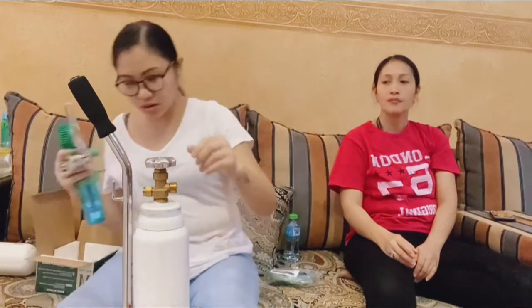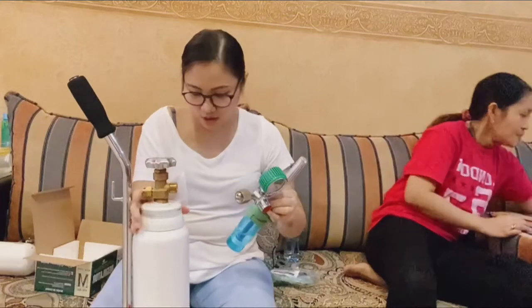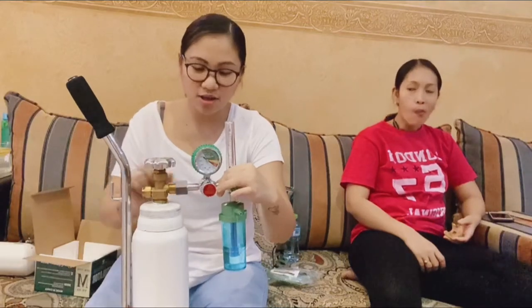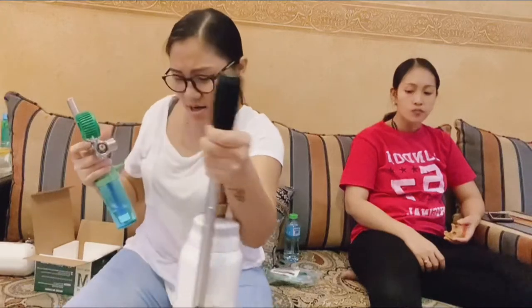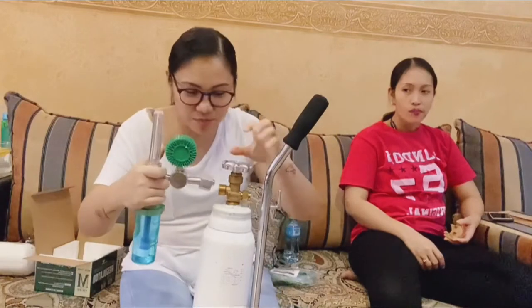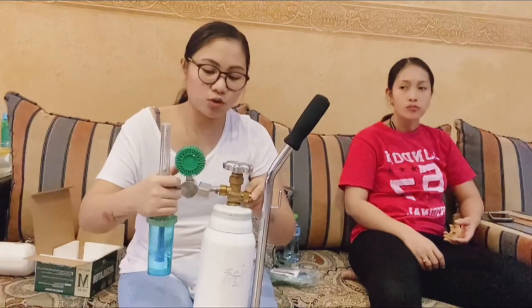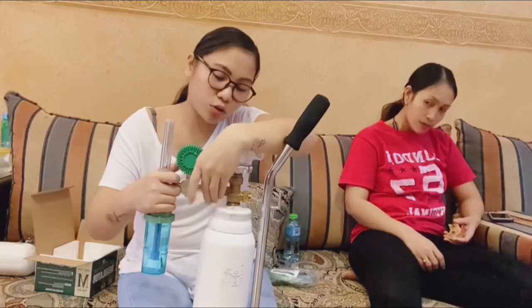So this one — we attach it here. The machine will be fixed there. This is how the attachment goes, guys. This is how you connect it. What I have to do is... careful, this might burst. I'll insert it here into the hole. This part will serve as the locking mechanism, guys.